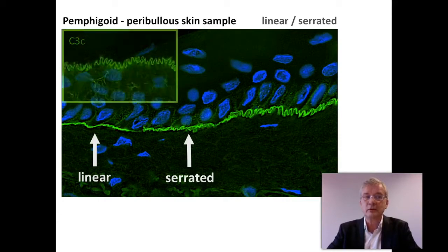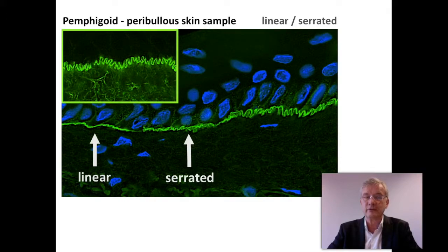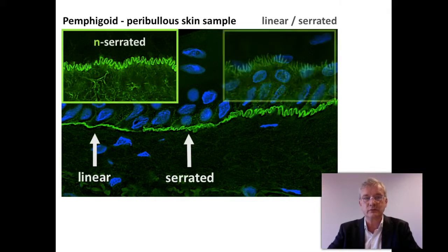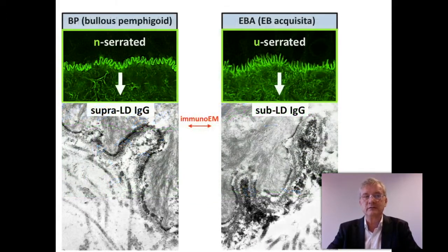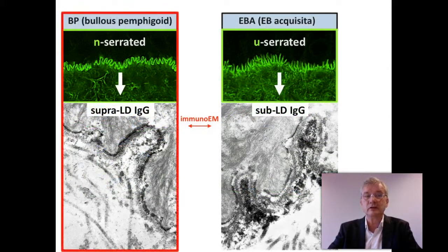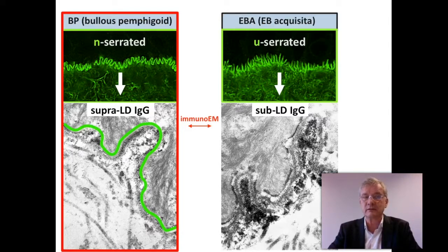There are two different serrated deposition patterns: the n-serrated and the u-serrated. The n-serrated pattern in bullous pemphigoid has a deposition above the lamina densa, where you can see a rounded top in this pattern that looks like an n.